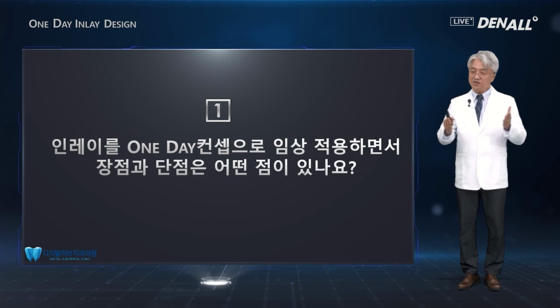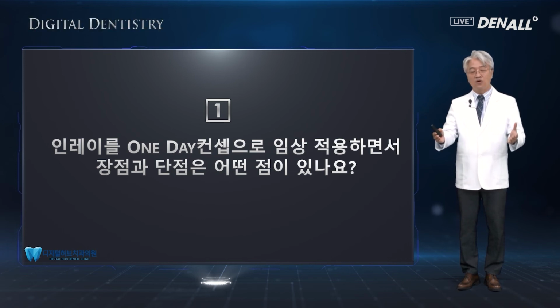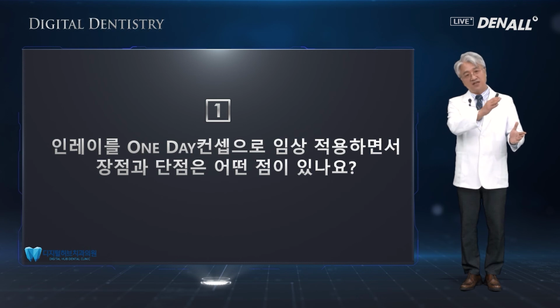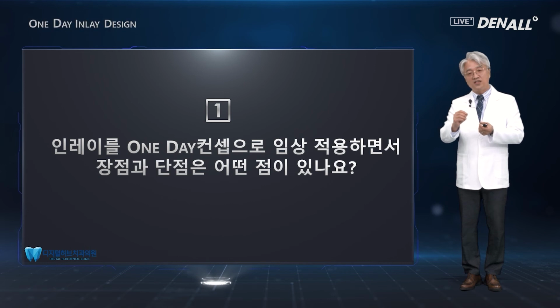All the more with the adoption of CAD/CAM system, with the CAD/CAM software, 3D printer, and oral scanners advancements, compared to when you had to remove the analogly, like you have to do rubber impression, you have to do stone work, and in CAD you do design, but in actual inlay, manually you have to make the inlay, which takes a lot of time and efforts.